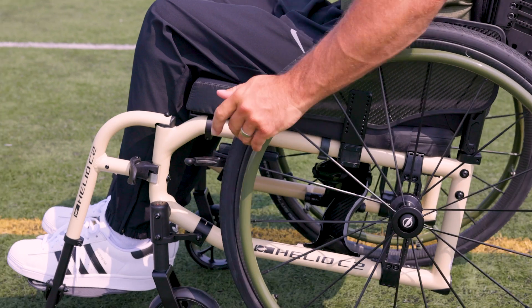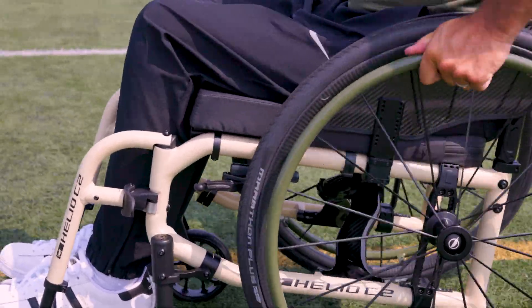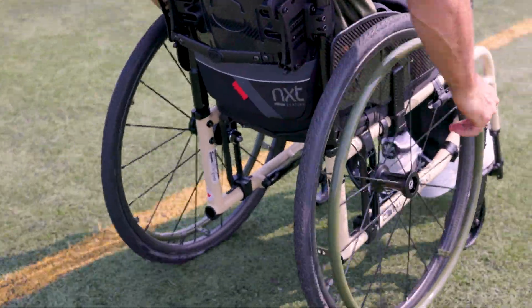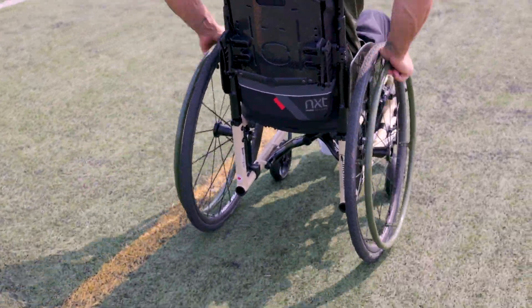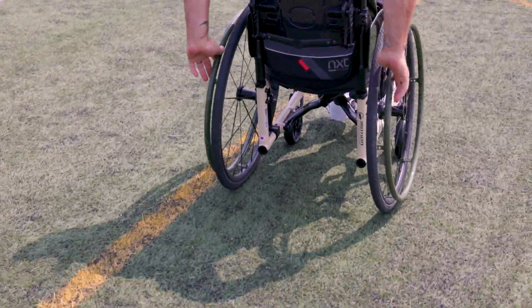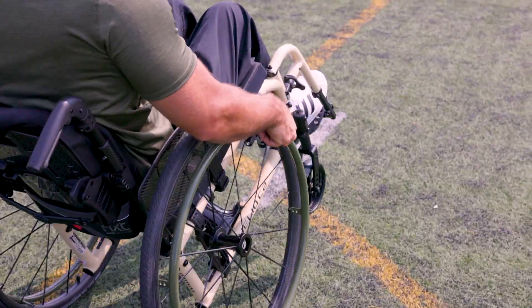Once you have what you think could be the client's ideal horizontal setup, have the client propel the wheelchair in similar environments to their daily routine. This can include mobility on a variety of terrains, transfers, as well as daily activities. Make adjustments accordingly.